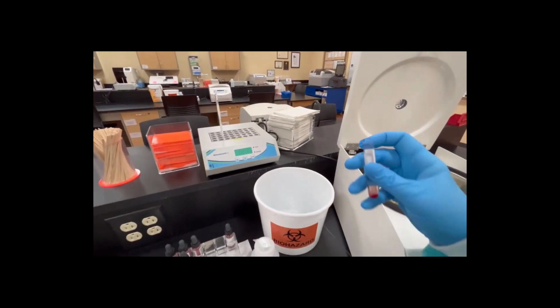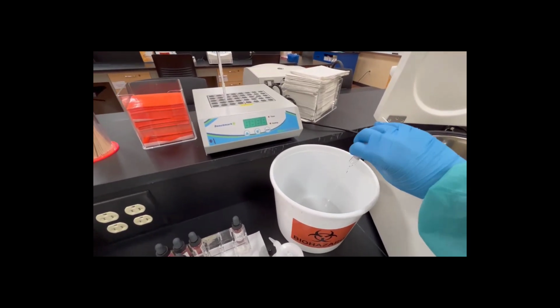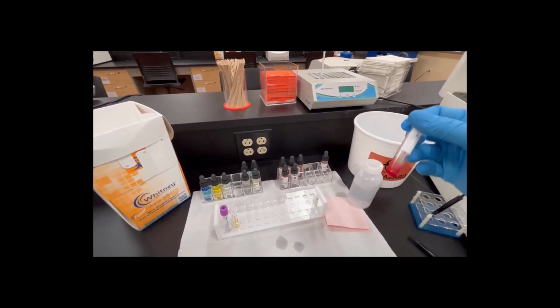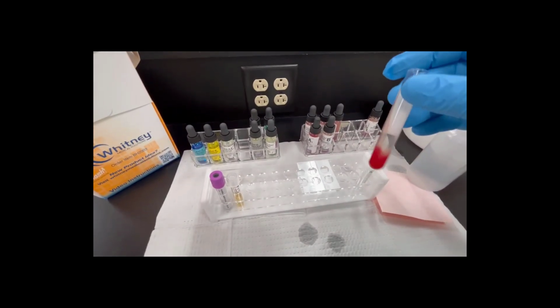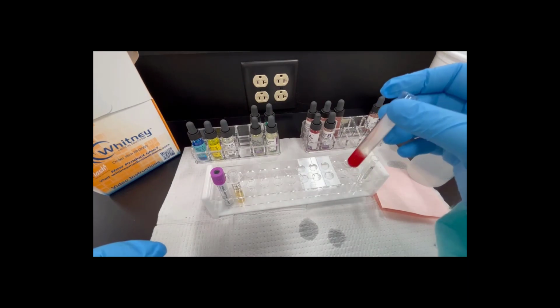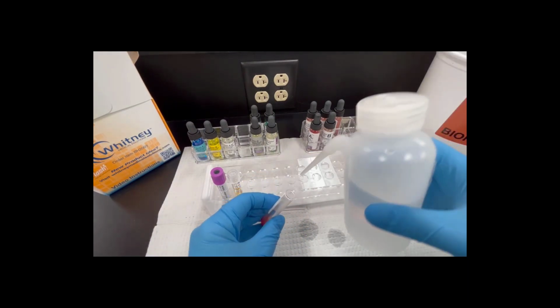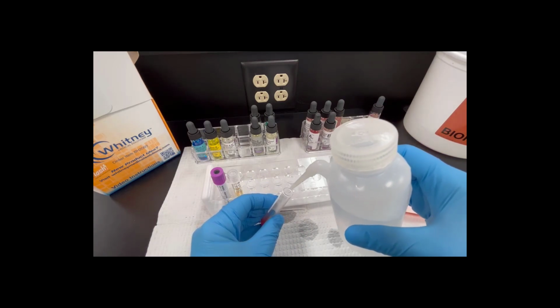That's okay. We're going to take it and dump it into our bucket with a disinfectant. Some cells come out. That's okay. It's going to happen. That's why after the class we wash it so well. Then I'm going to give it a nice shake, make sure that cell button is off the bottom, and now we're going to add saline. Oops, I hit the tube.